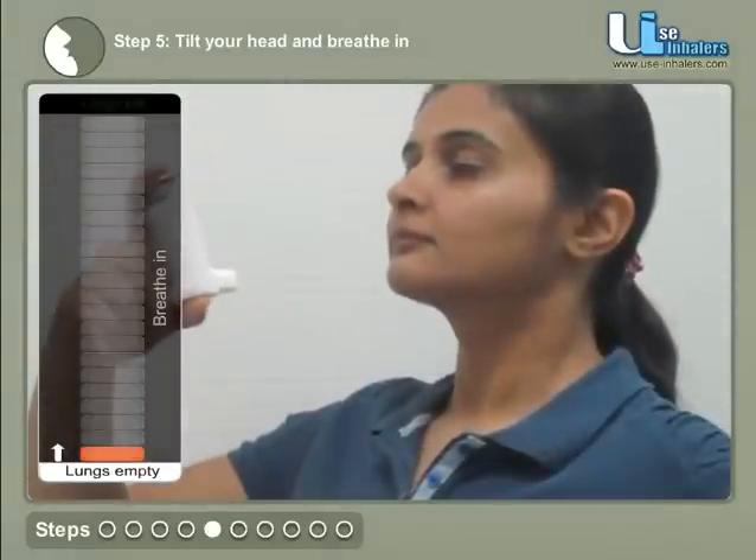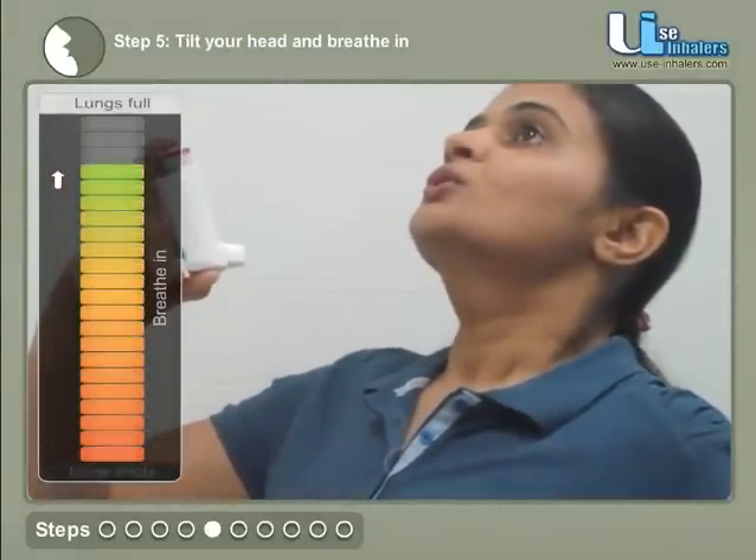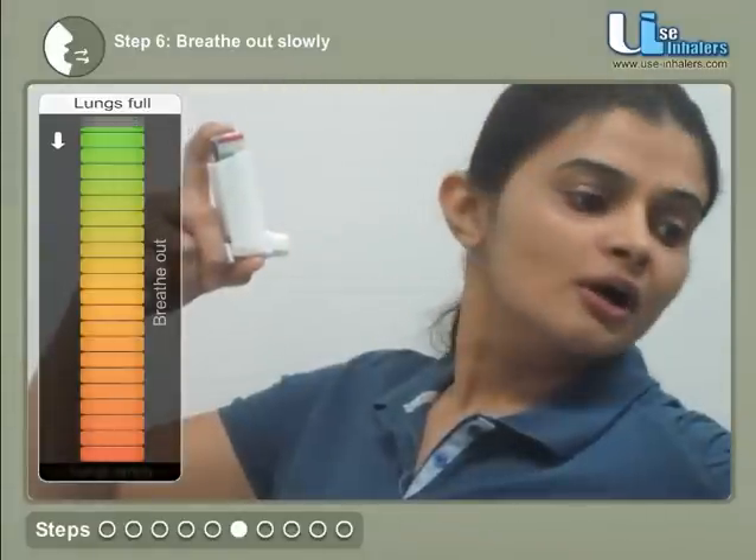Tilt your head back slightly and breathe in. Breathe out all the way.